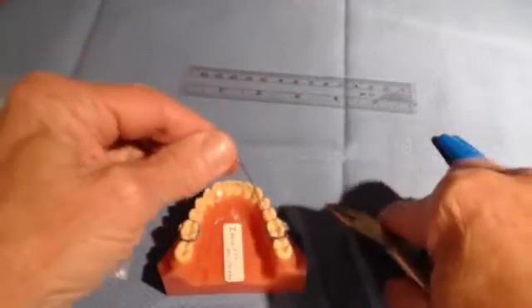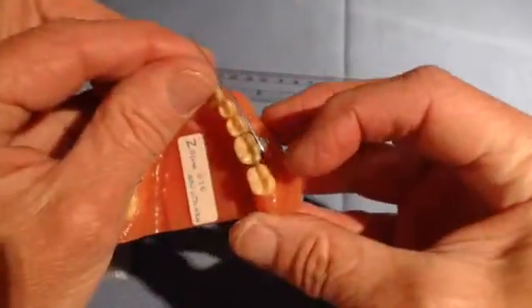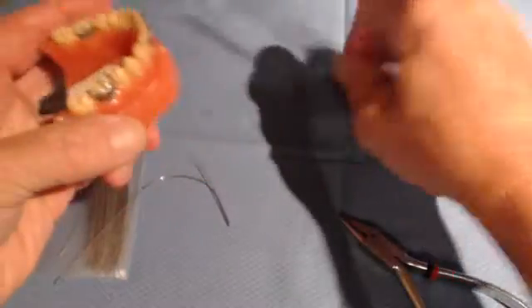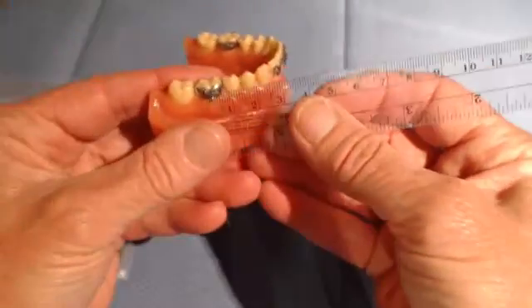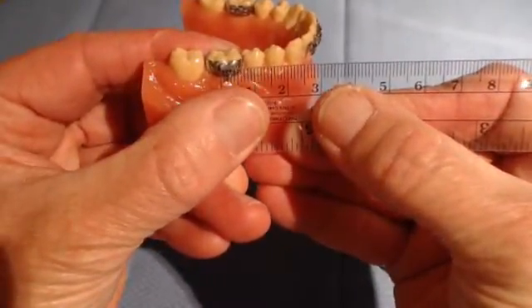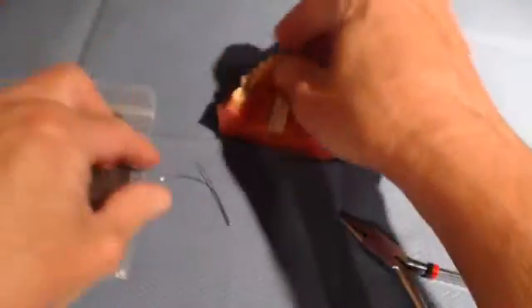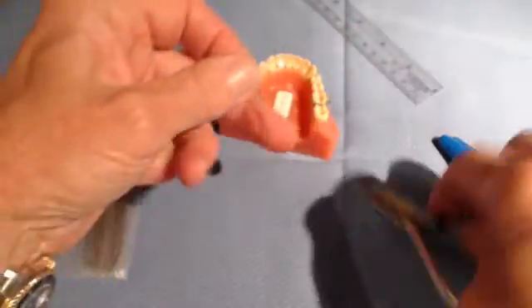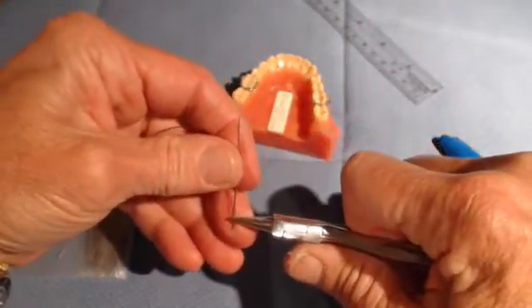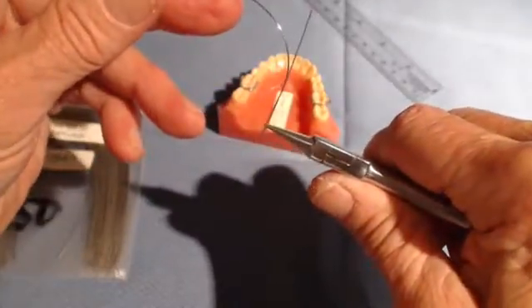Next, you would put it back in the arch and then mark it at the mesial of the tube. But I'm going to estimate where that is because we know that molar tubes in the POS system are generally three millimeters wide. So I can estimate that and expedite this procedure. So again, I will bend around the round end of the plier, putting it right there at three millimeters from the tube.